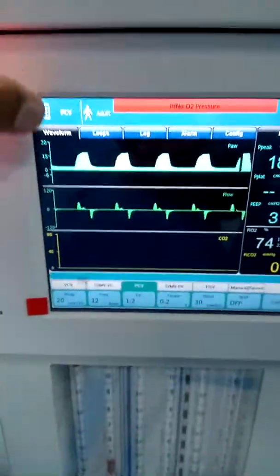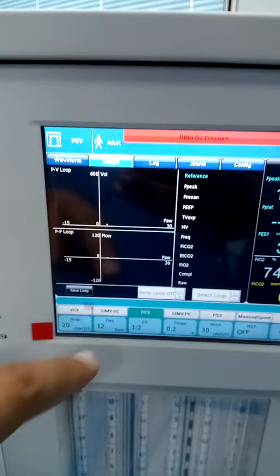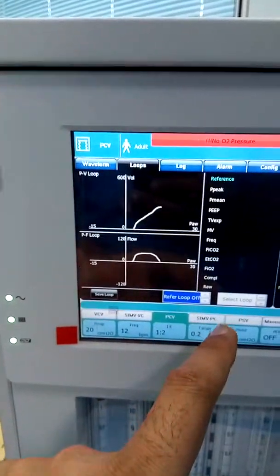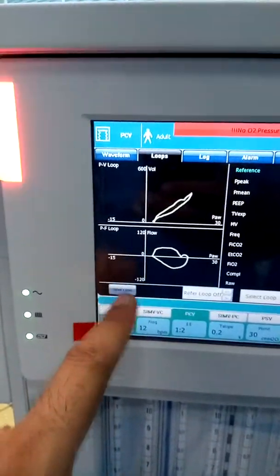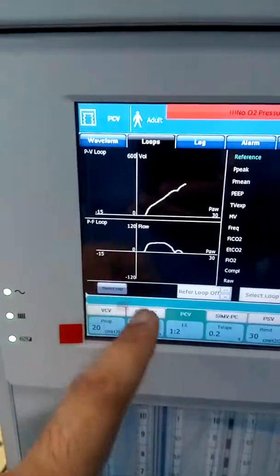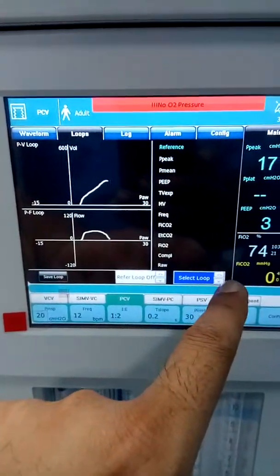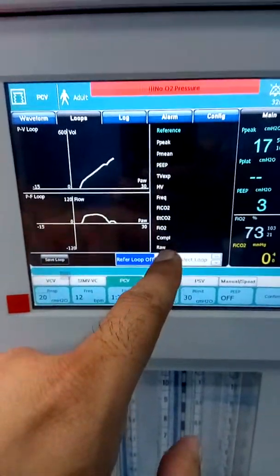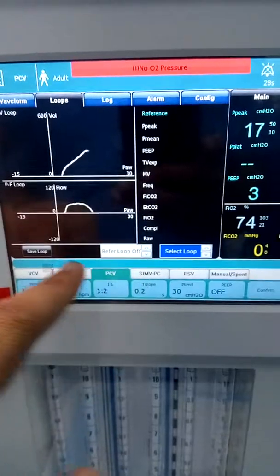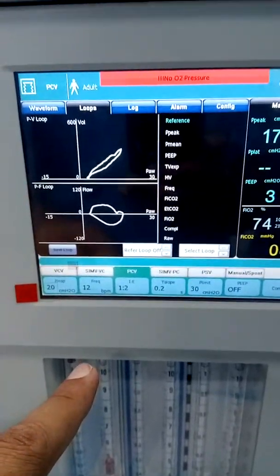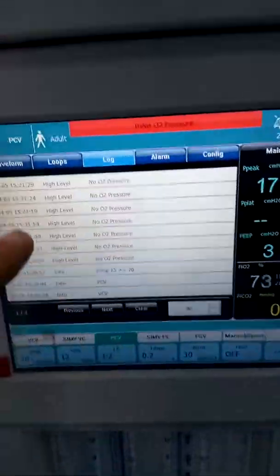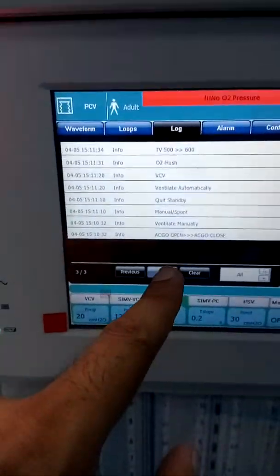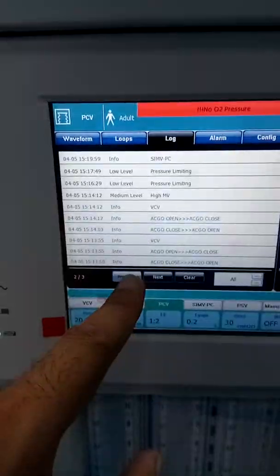In this area you can see the waveforms. Loops are here — you can view the loops, save a reference loop, and there is an option to save the loop. You can see all the loops in this section, along with all the alarms and pressure data — everything that is happening is visible here.